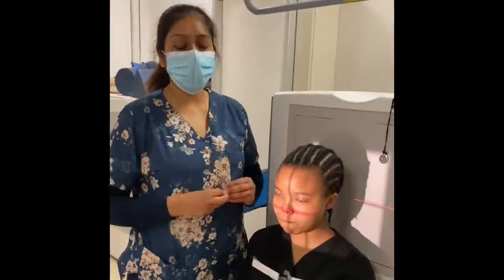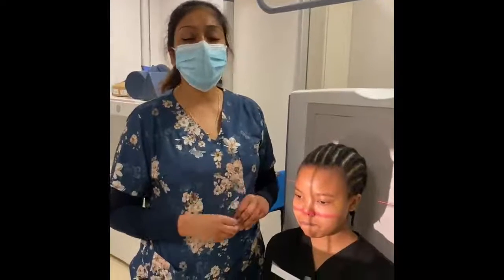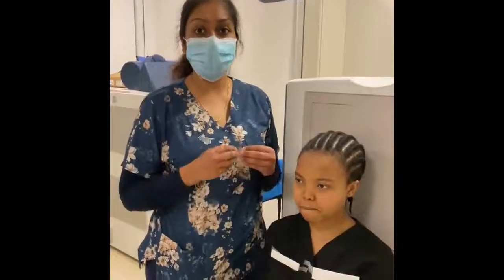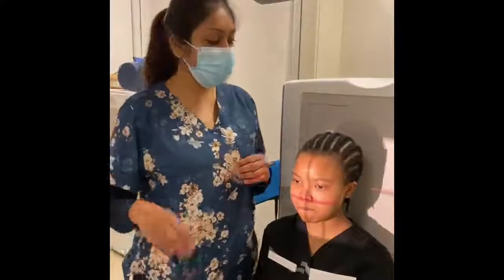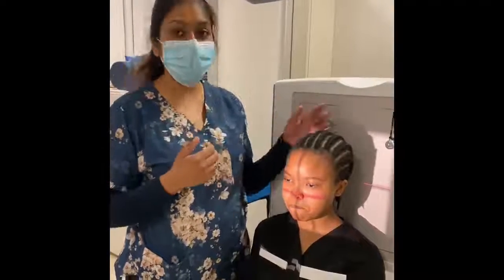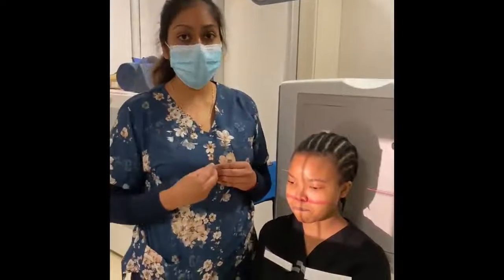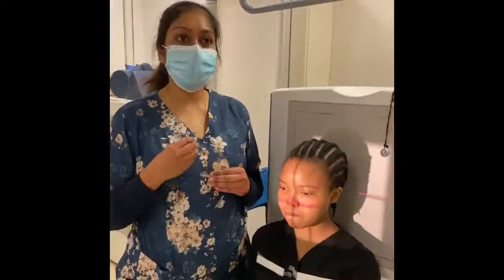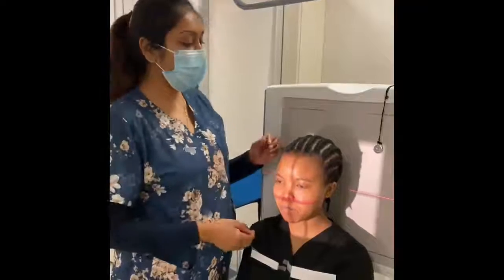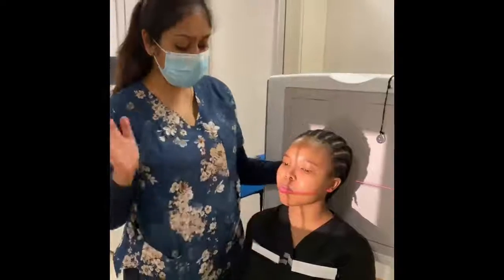Okay, so we're going to demonstrate now the SMV or your submental vertex projection. This projection is actually very uncomfortable for your patient. So when I'm demonstrating, I'm going to be as quick as possible. In terms of your beam, you're going to use a horizontal beam directed perpendicular to your image receptor. In terms of your centering point, we're centering in the mid-sagittal plane at the level about 4 centimeters inferiorly to your mandibular symphysis.